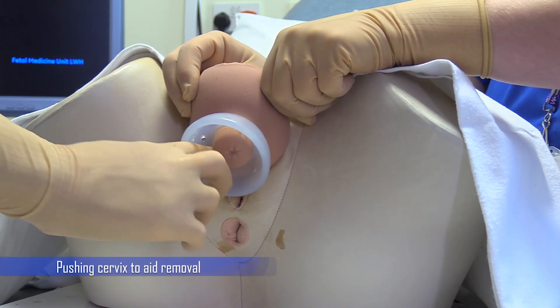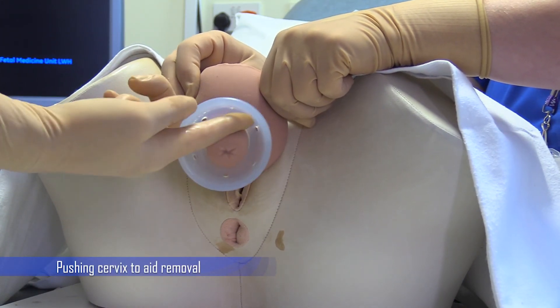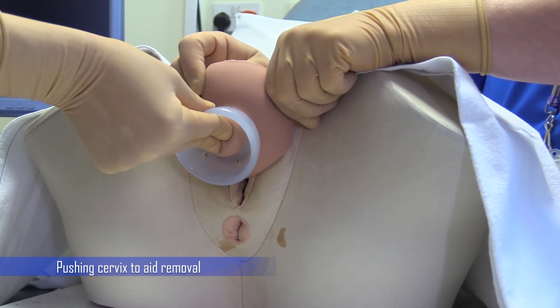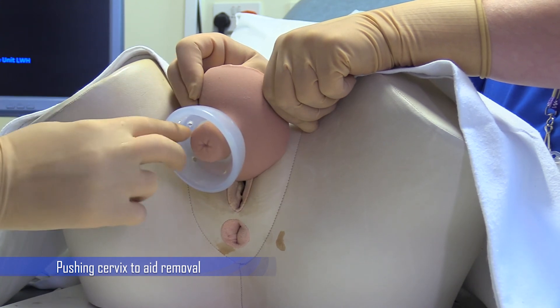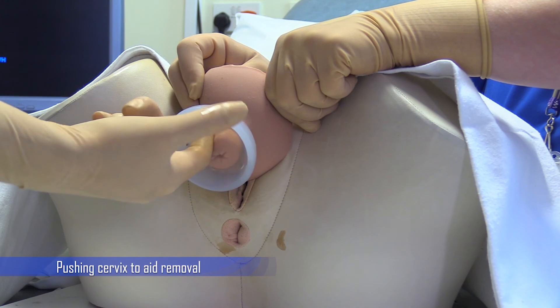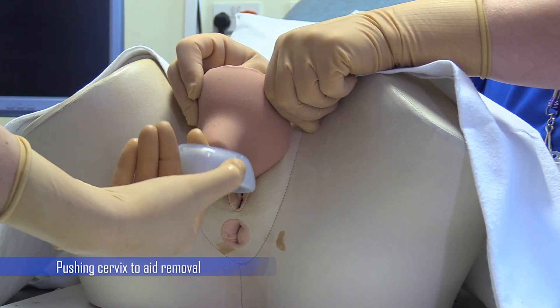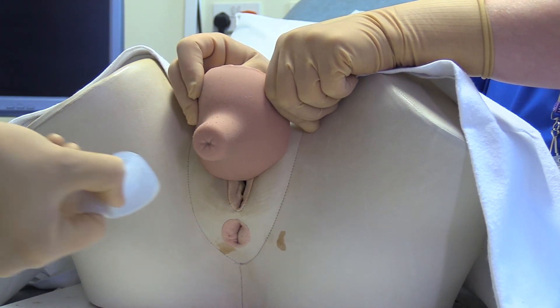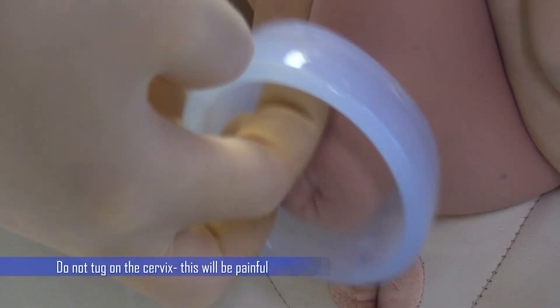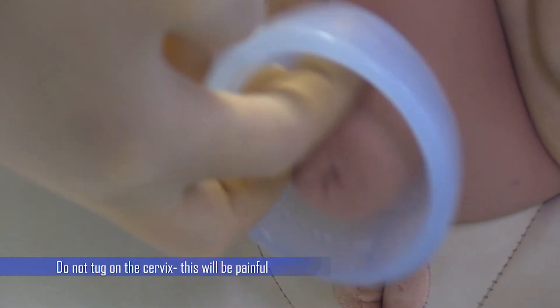If it is hard to access the space between the pessary and cervix, it can be helpful to push on the cervix and use the thumb to bring the pessary forwards a little, then insert the finger between the cervix and pessary in the normal way. Pessary removal can be painful if the pessary tugs on the cervix, and this should be avoided.